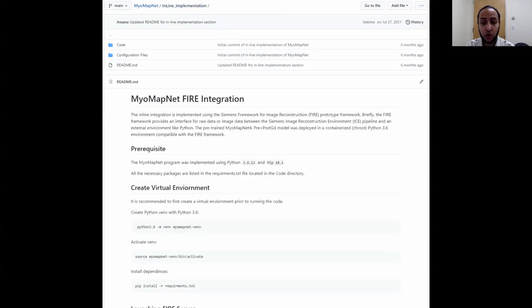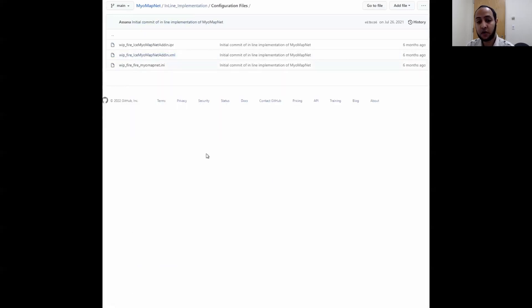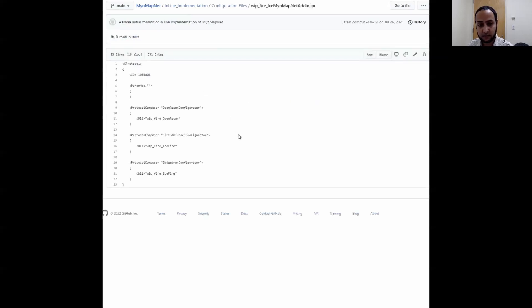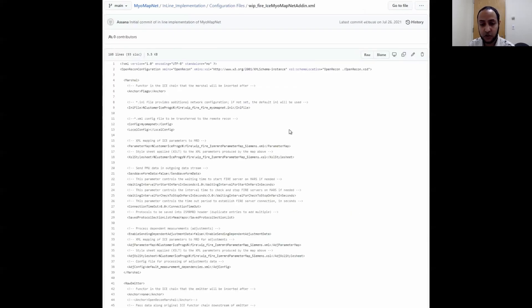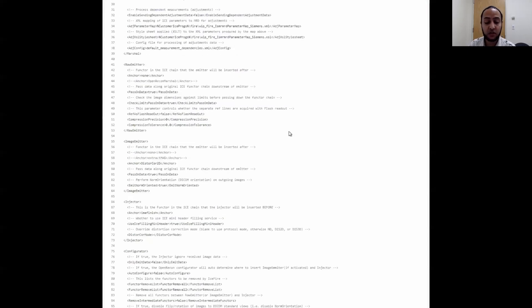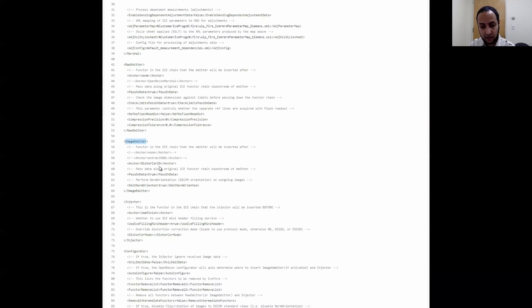In addition to the code, there are three configuration files. The first is the IPR file, which is used to add the FIRE emitter and FIRE injector into the ICE sequence. The second is an XML file, which is used to configure various settings on the FIRE server to meet our needs. One important setting is the location of the FIRE emitter, which is set under the raw emitter tag when sending k-space data, or under the image emitter tag when sending image data. In the case of MyoMapNet, we placed the FIRE emitter after the T1-weighted images had been generated and motion-corrected on the scanner.